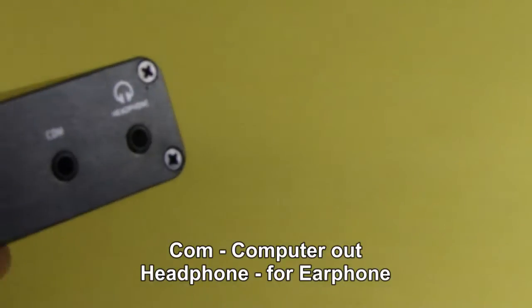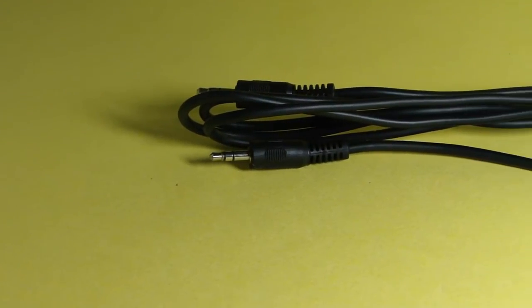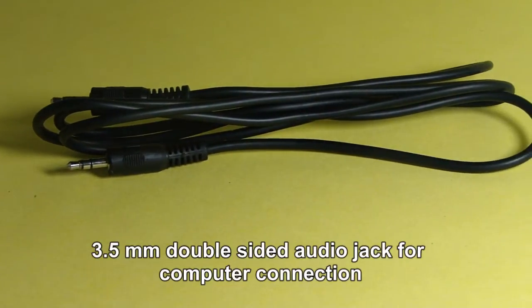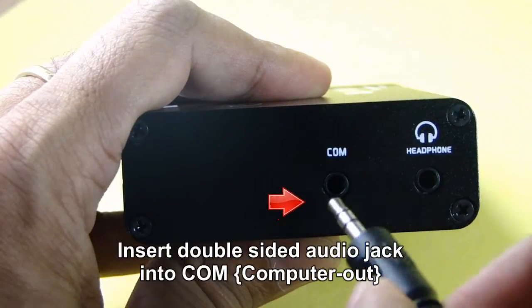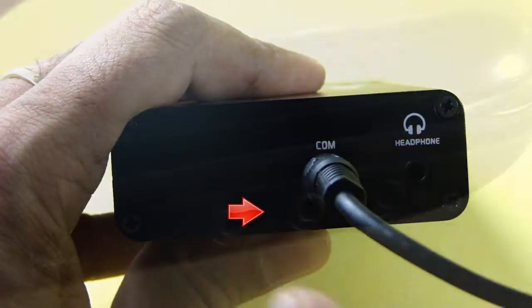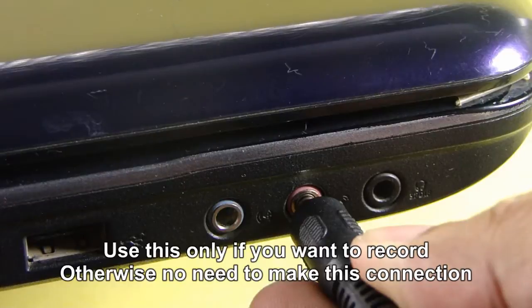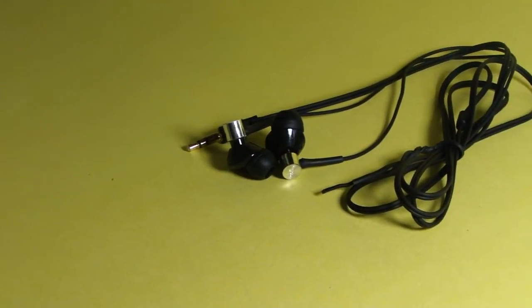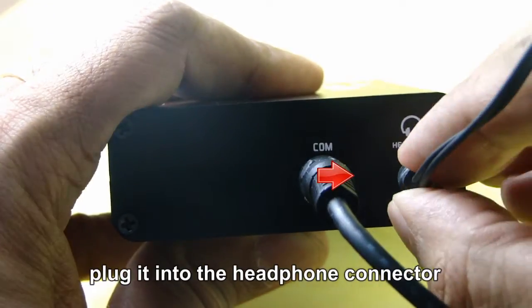Now let us look at the back panel. It has two connectors: one for the computer and another for the earphone. This is a double-sided audio cable. One end goes into the COM port of the digiscope unit, and the other end goes into the line-in port of the computer or laptop. If you don't want to record, don't make this connection. This is the earphone with good bass for better sound — plug it into the headphone connector.